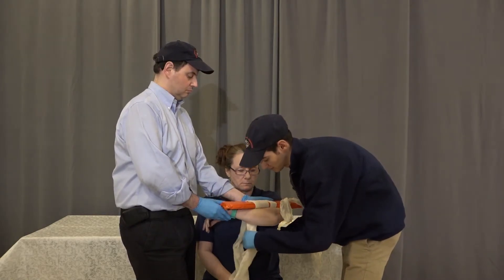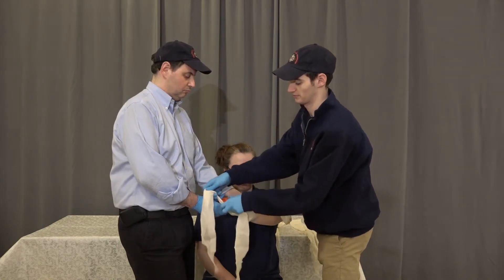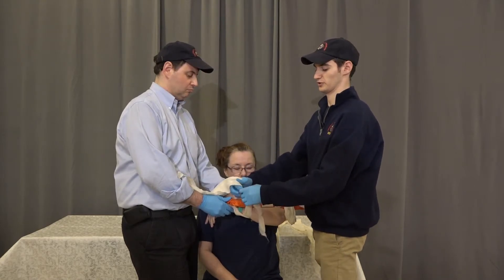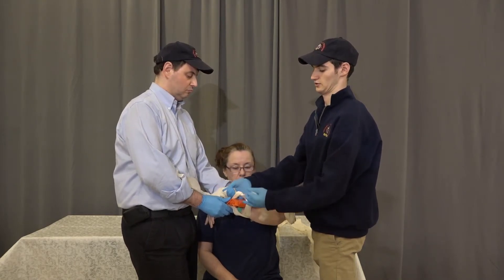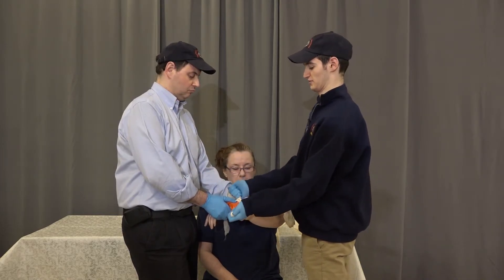We're going to do the same thing on the bottom — twist it, come up, and tie a surgeon's knot on top of the board again. Nice and snug to prevent movement.